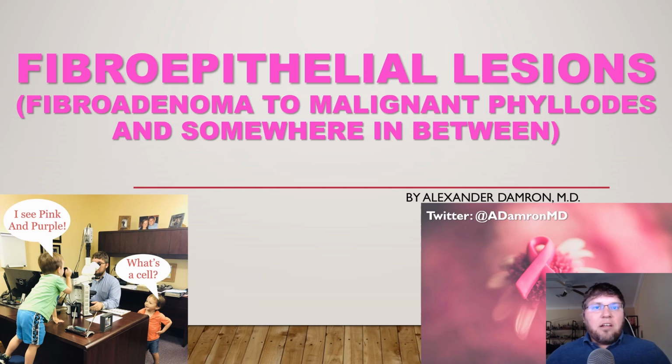And then we'll also go over some gray zones in the Phyllodes family, right? When we go from benign to borderline to malignant. And I'm really going to focus on those in-between areas when you're struggling a little bit. You're thinking, is it enough or is it not enough? Things like that actually can become tricky.